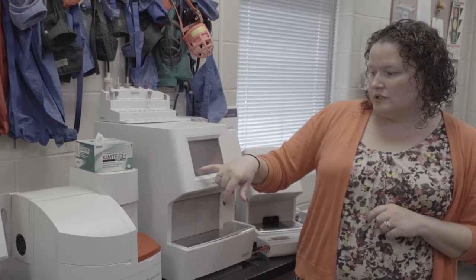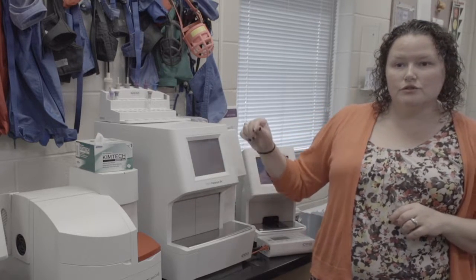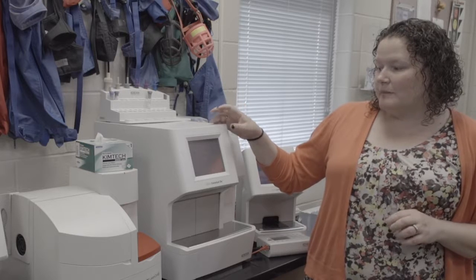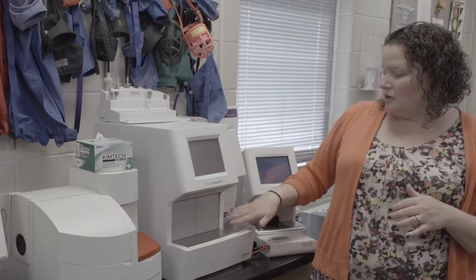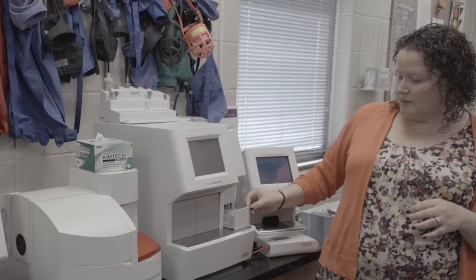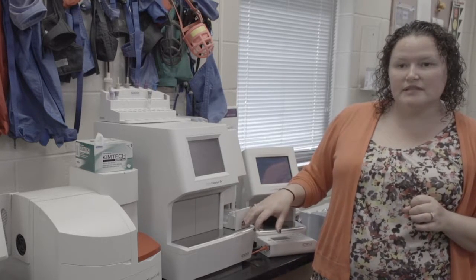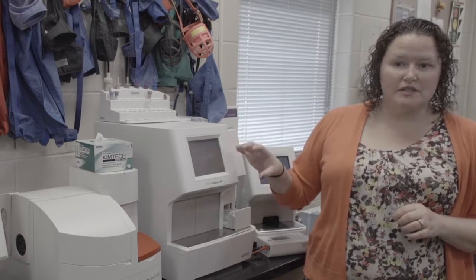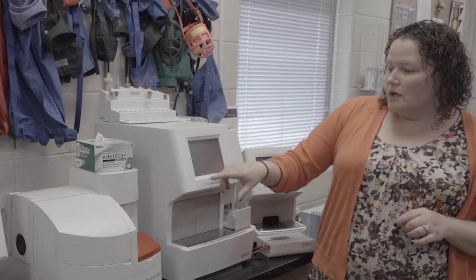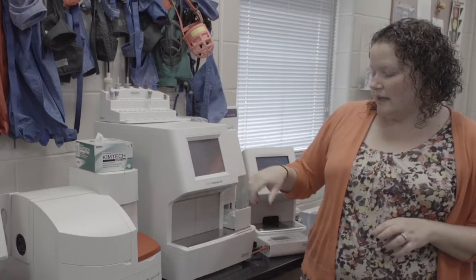Down here under dilution, it's always default to none, but this analyzer has the capability to run your dilutions for you. So that being said, it would walk you through adding a sample in an individual slide. Say you got a really high creatinine that you needed to dilute. And then over here, in your tip drawer, it would talk you through adding an empty cup and a cup with 300 microliters of saline. And no worries, because it's going to show you pictures on the screen of what it wants and how much of each thing to put in there. So we are going to tell it that we're just running plasma, and then we would hit next.